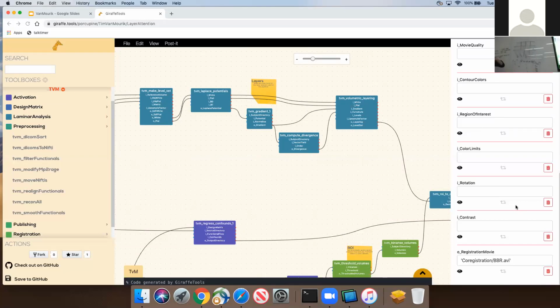Now, often throw in, isn't that the same assumption that very often is used anyway? I'm very curious what you think about that. Whenever we do layer-specific analysis, well, we would like to say something about the signal in a region of interest. So we're averaging anyway. So we're thereby implicitly assuming homogeneity of the layer signal over that region.